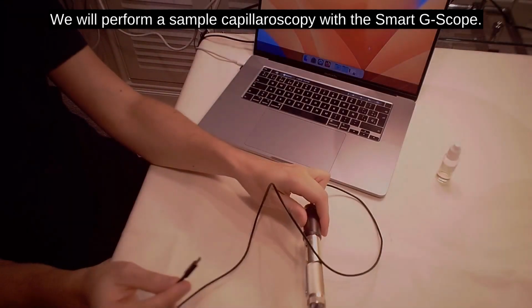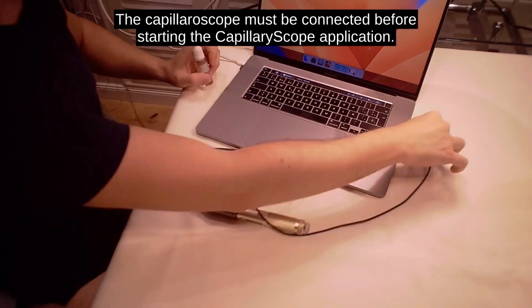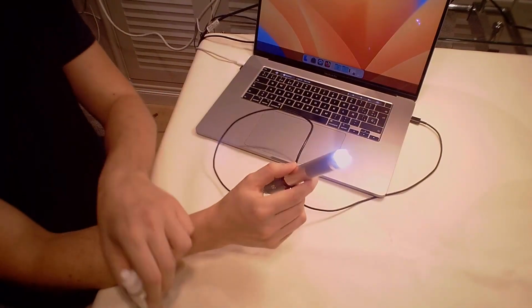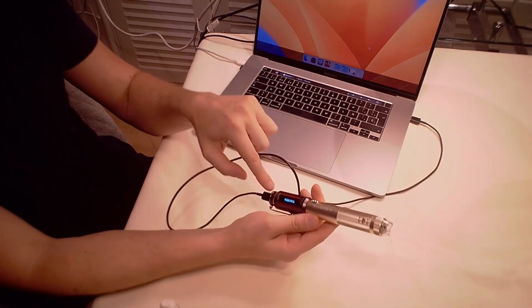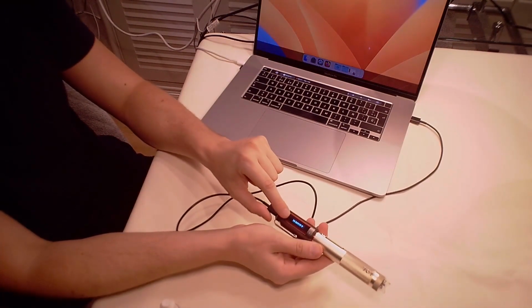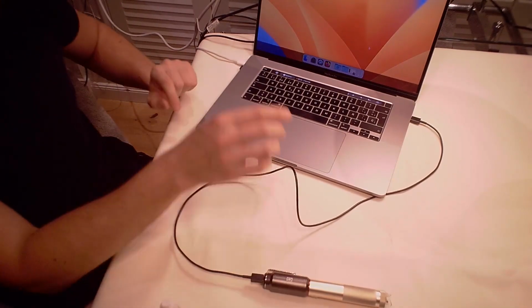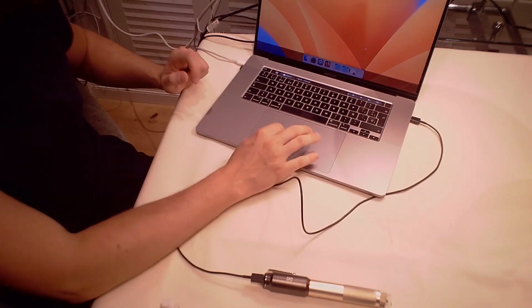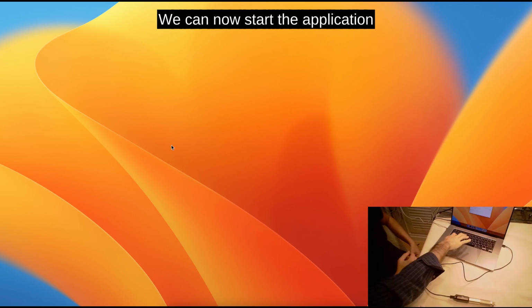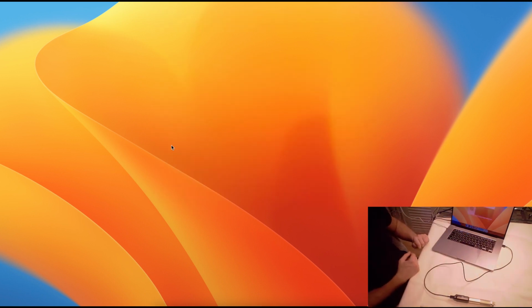This is how we are going to do a capillaroscopy. An important detail, although very easy, is that the first thing we have to do when we want to use the Capillary app is to connect the videocapillaroscope before starting the application, so it can be correctly recognized. In this example, we are using the G-scope, and we see that the light turns on when we connect the system, and the software automatically recognizes the capillaroscope.